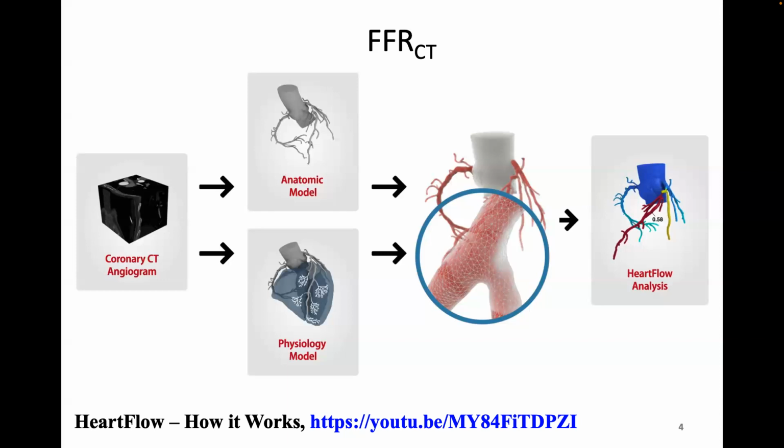If you can use FFRCT to keep people out of the cath lab, to say, look, yes, there's a lesion here, but it does not reach the threshold, right? If you go to the cath lab, when they do FFR, you will not have a value that's below 0.8, then it's a win for everybody. It's a win for the patient, and it's a win for the people looking after that patient, Medicare or the insurer. And so this company, basically, that was the outcome from their trials.